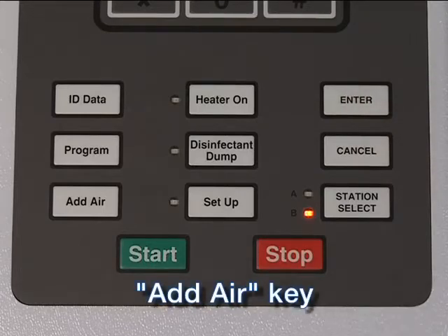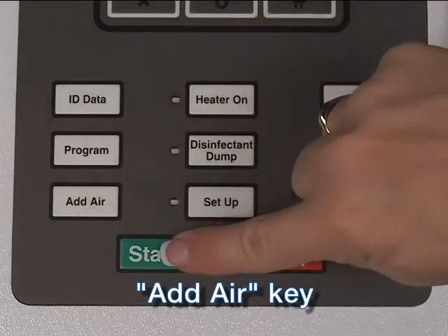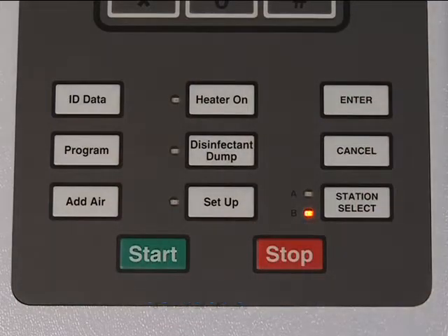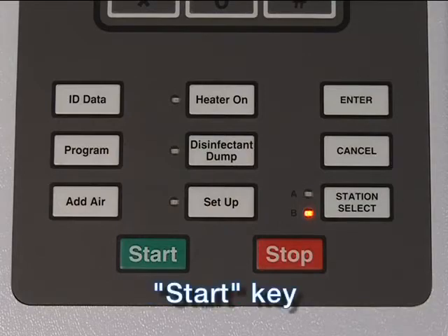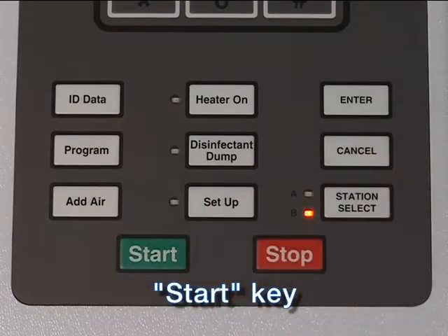The Add Air key: press this key, then the Start key to air purge the endoscope, or press during the cycle to add an extra air purge onto the end of the cycle. The Start key starts a disinfection cycle, resumes an interrupted cycle in the station selected, or starts some system functions.